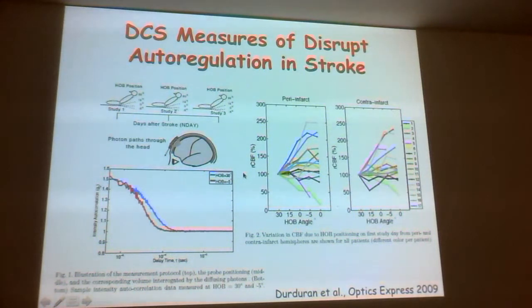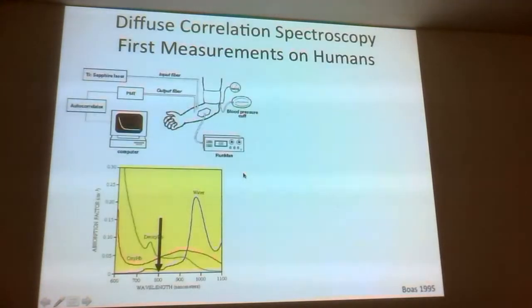I thought that was really compelling because it's a relatively simple instrument that could just tell the nurse whether the patient should be sitting up or lying down to help them get less effects from their stroke. And when is better to do this cuff?